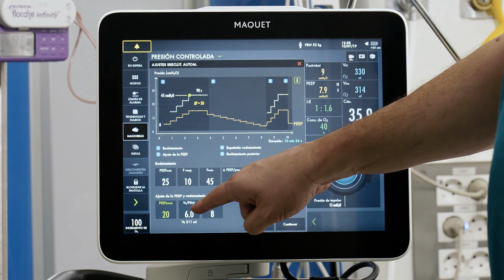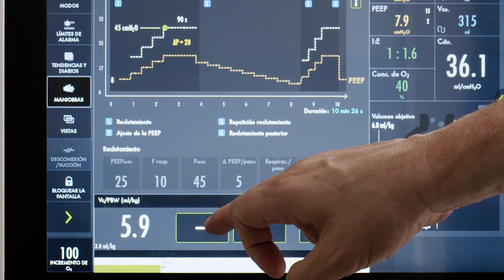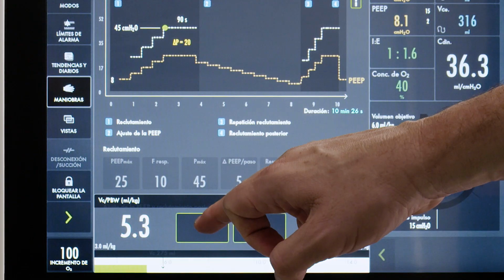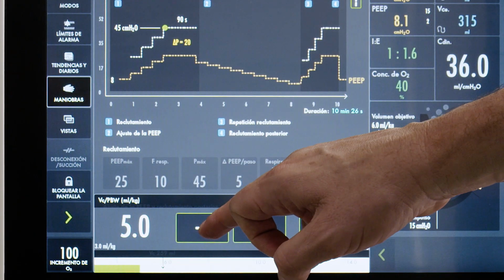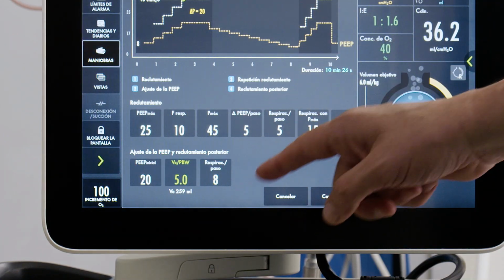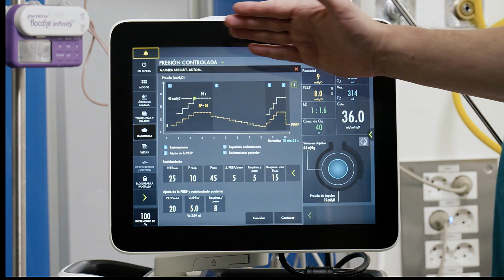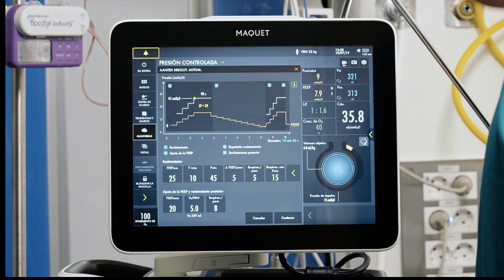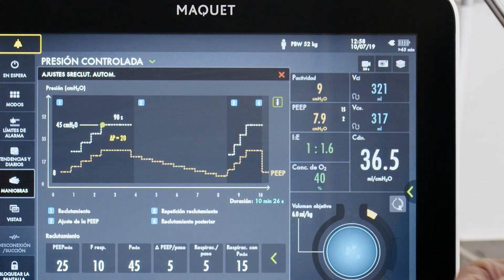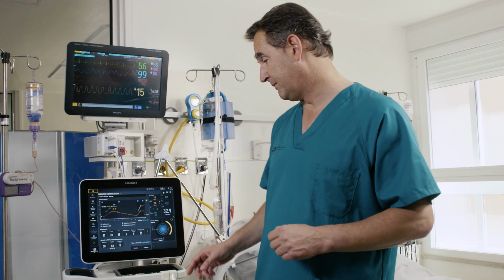As during this phase, the ventilator mode will be volume control ventilation, we'll select it at 5 mL per kilo in order to minimize errors in the determination of compliance, and especially not to underestimate the level of PEEP, or the closing pressure. So 5 mL per kilo is now selected. And finally, we can also select the time we want to spend at each decremental PEEP step, which is also determined by the rate, and we will stay 8 breaths each time.